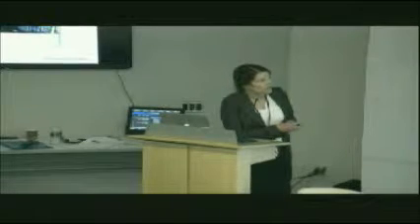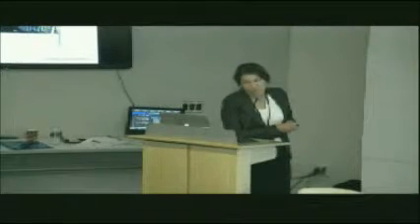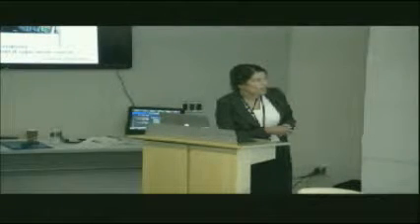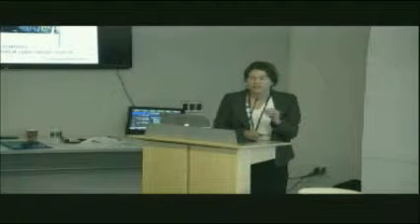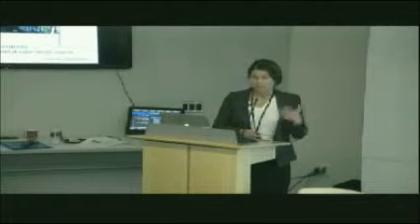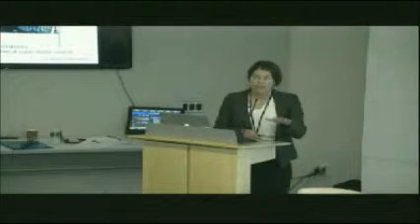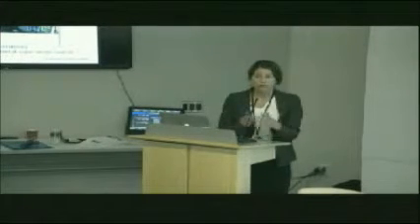So you can imagine that it's stronger here than it is there. That's basically all this is telling you. And it's important to recognize that this is a great tool because now we can elicit changes in the neurons that go all the way up to here, right? But we're not just changing the neurons that are excitatory or causing more movement. We're also exciting the neurons that are damping things down. So it's the total composite of that activity.